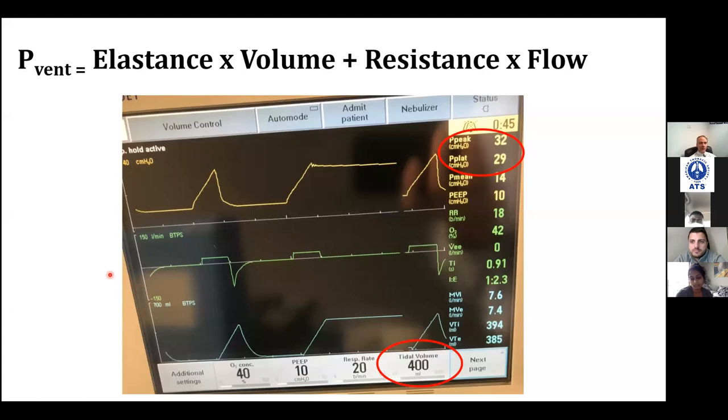And is this going to be okay, or are we going to need to do something about it? Don't know, right? Sometimes we let people ride with a high CO2. What's that called? Permissive hypercapnia. Good job, permissive hypercapnia. And in ARDS, we do that all the time. Down to, I don't know, what's your favorite pH? How low will you let somebody go?